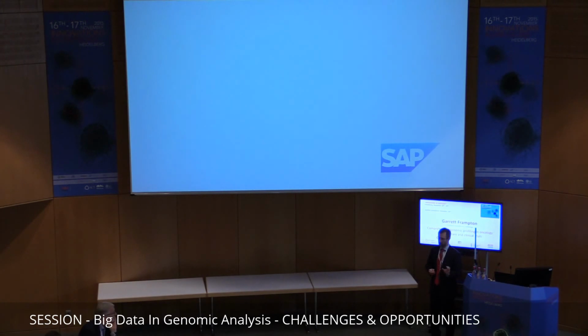So we test just the tumor specimen. We do not make the determination whether a particular mutation is somatic or germline in that patient. And so on the report, we will say this mutation has been observed to be germline. We advise doing germline testing. I think the way we do it in the text section of our report is missed by some physicians sometimes. So we're trying to figure out what the right way to highlight that is without confusing people as well, because there's a lot of different levels of understanding of this material. And so figuring out the right way to report that to all of our customers is a challenge.